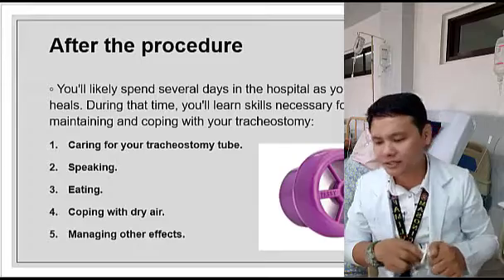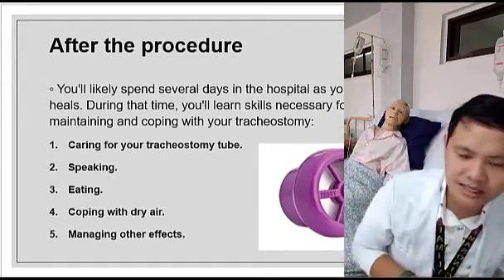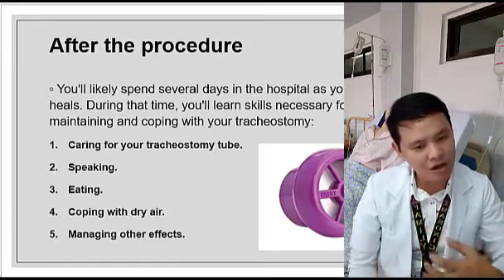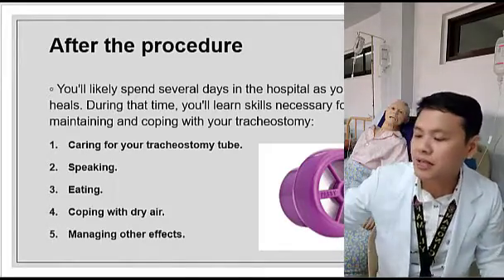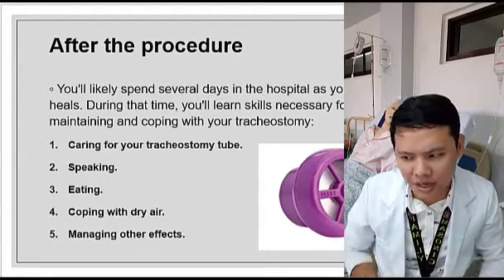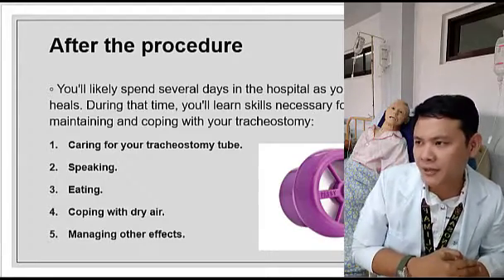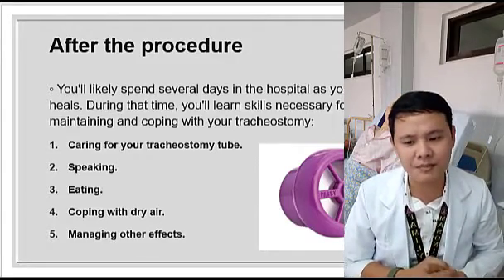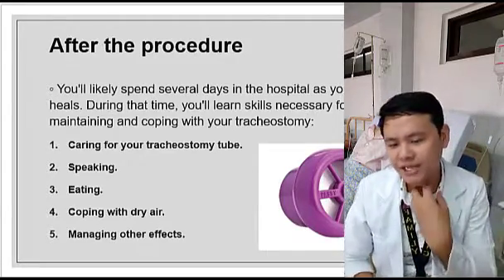If ever na magkaroon ng dry air, it may irritate the trachea. Okay, so it may irritate the trachea, baka ubuhin yung pasyente natin. So it takes time for you to cope up with a dry air. So there are many ways naman para makapag-cope up ka dyan eh. Meron pong ginagamit na mga devices para ma-humidify yung hangin na pumapasok.